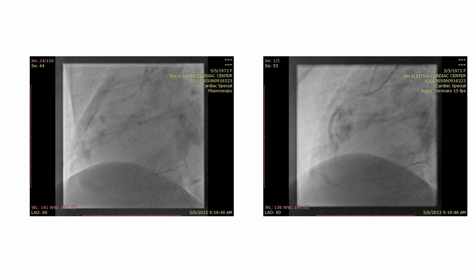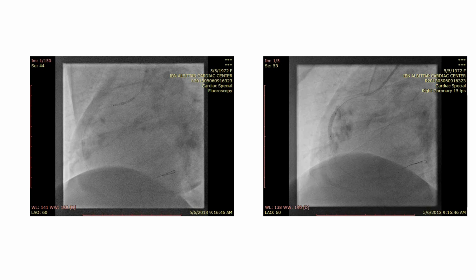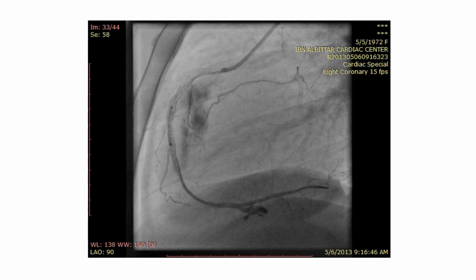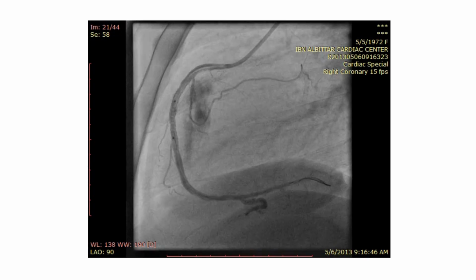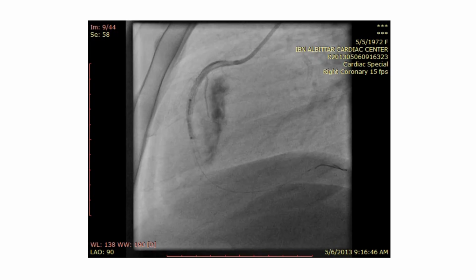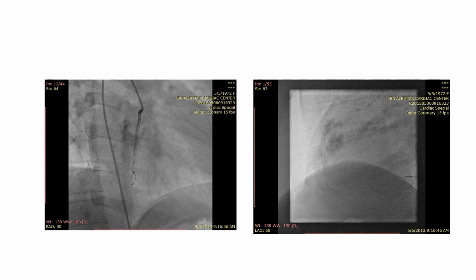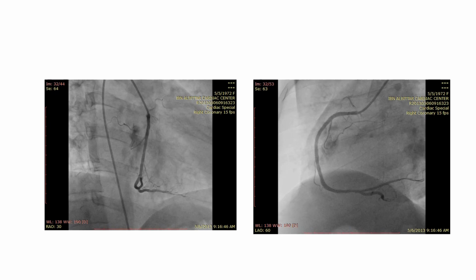So the first stent was delivered and inflated in place. The patient required another stent, a little bit more distal with overlap to the proximal stent, and inflated to a higher pressure again, and this was successful in sealing the perforation completely.